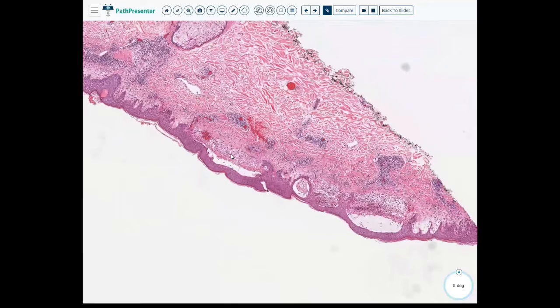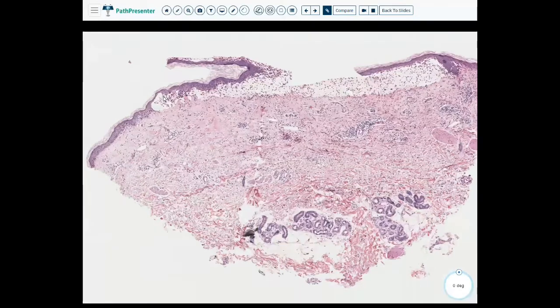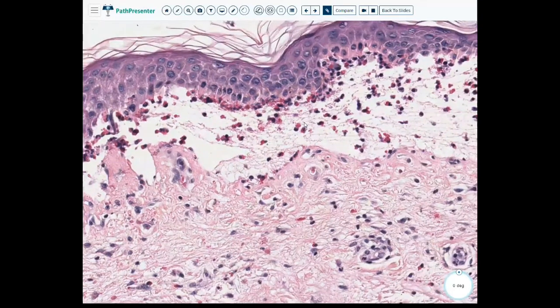Case 13, well, here's our pathology right here. So we had this very large bulla, and it looks like there's a lot of cells in here. So that helps us feel confident that this is not just artifact. And if we go in, what we see is lots of disco balls or over-the-ear headphones with these really red, granular, intensely eosinophilic cytoplasm.